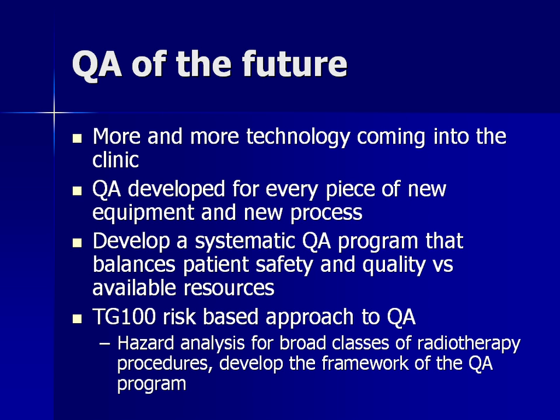So the AAPM has formed a task group. They've been around for a year or so, but they're taking a look at this new paradigm where there's going to be more of a risk-based approach to QA. And they're using hazard analysis, looking at broad classes of radiotherapy procedures, looking at each step, and where is the risk involved, where do there need to be more checks or fewer checks.